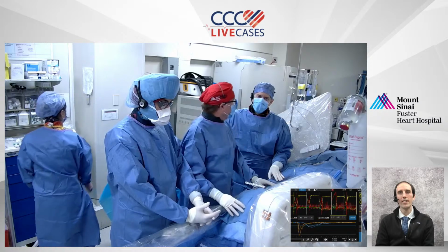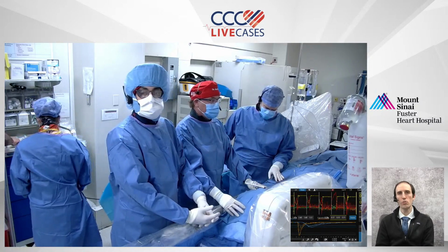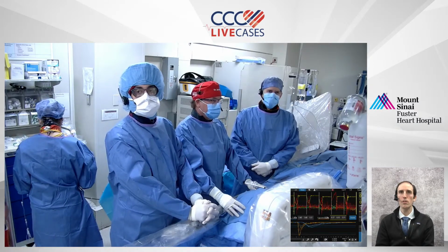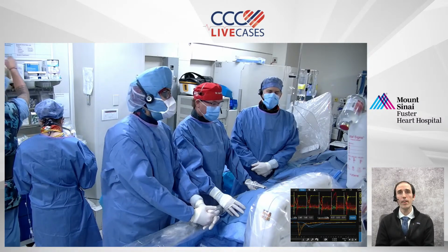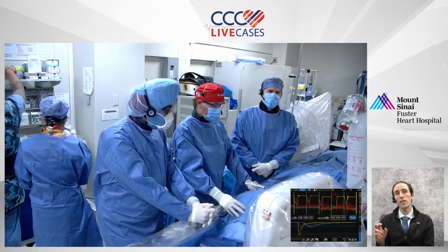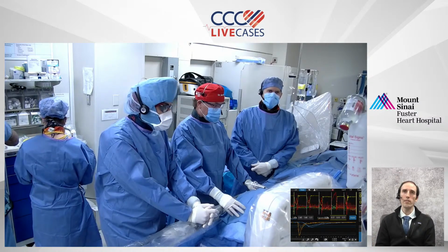Yeah, completely agree. I found there's a lot of patients who really truly appreciate this kind of testing, particularly after they've been bounced around and falsely reassured or dismissed, quite honestly. And so to have somebody take them seriously, do all the testing, and get to a diagnosis, or a diagnosis of non-cardiac chest pain, which is equally powerful, is so critical.